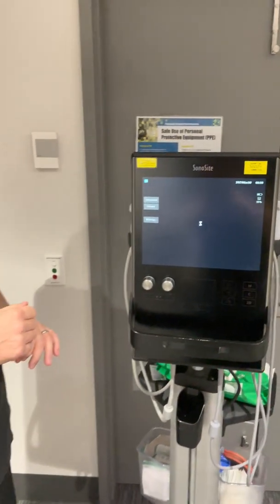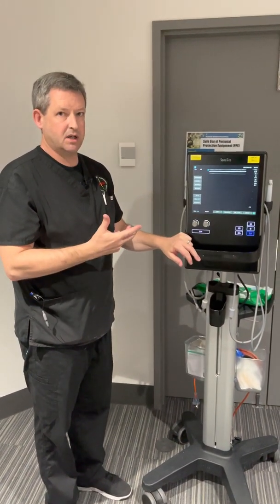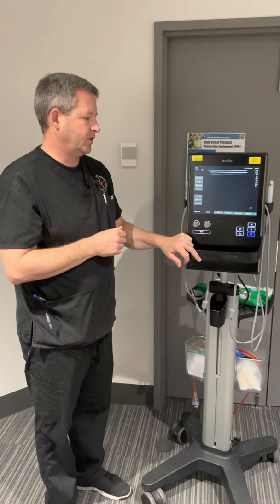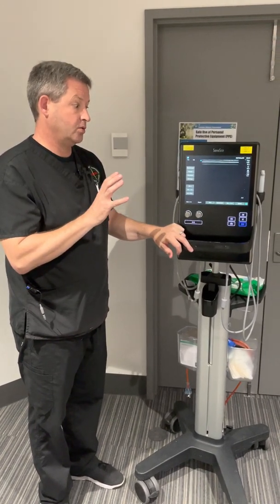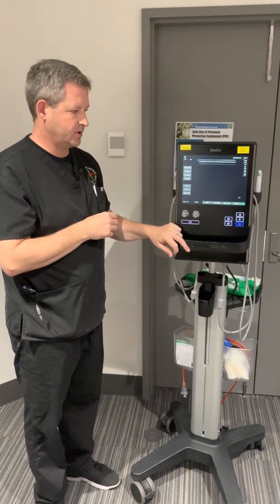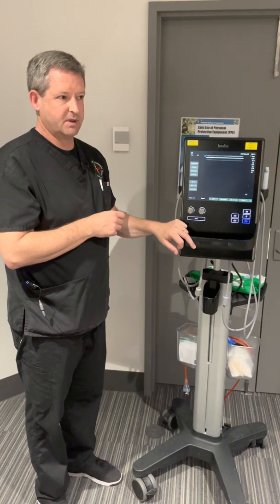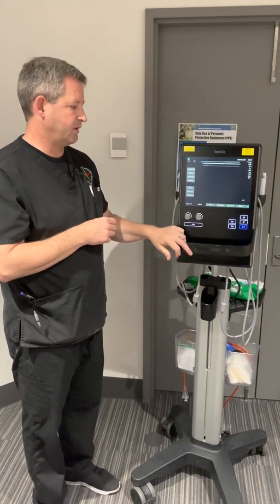For most procedures, we don't recommend keeping images because it's very much a real-time process. To do the procedure itself, you just need to be familiar with some of the controls. Rather than entering patient data, we expect you just to perform the procedure with cleaning before and after.